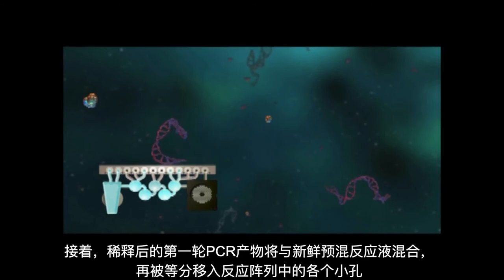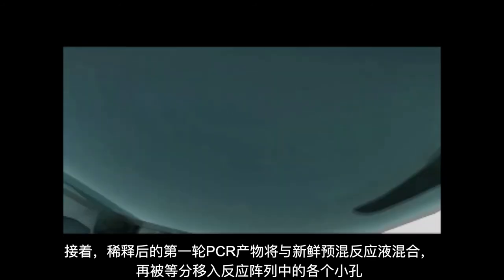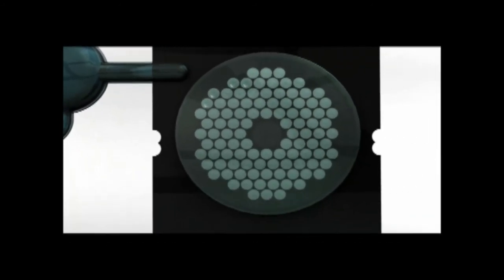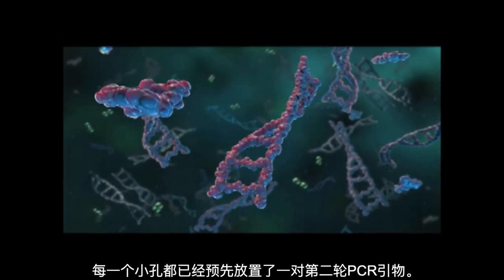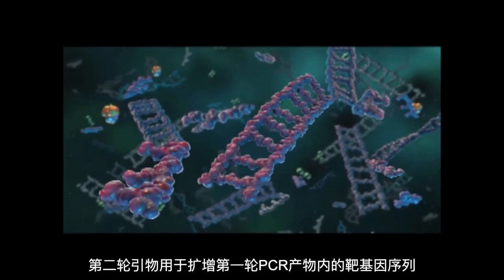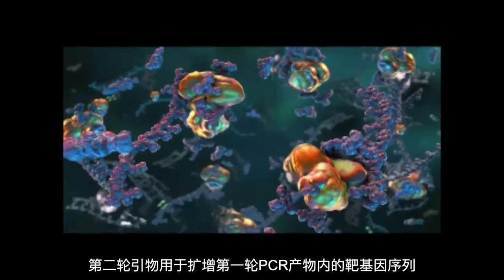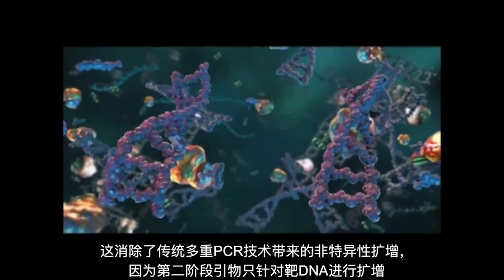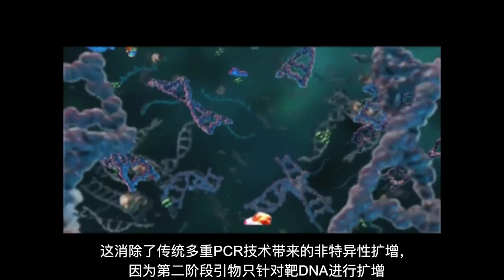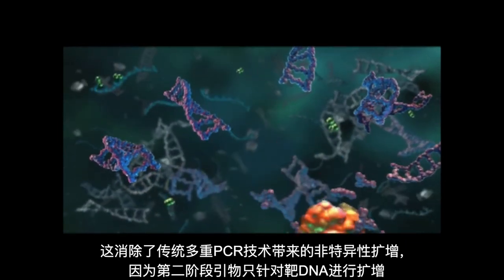Next, the diluted first stage PCR products are combined with a fresh master mix and then aliquoted to each well in the array. Each well of this array is pre-spotted with one pair of second stage PCR primers. These second stage PCR primers are designed to amplify sequences contained within the products from the first stage PCR. This eliminates non-specific products associated with traditional multiplex PCR, because the second stage primers specifically amplify only target DNA.